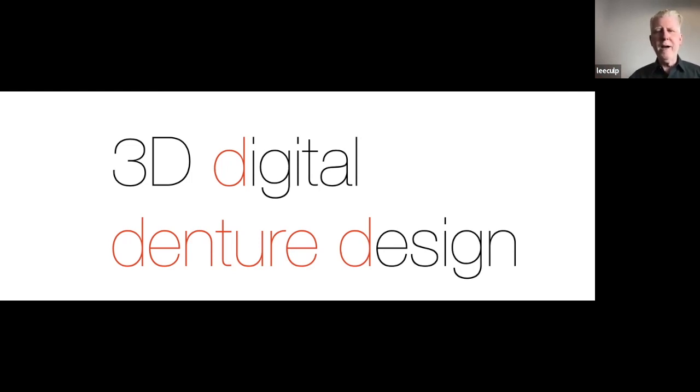So you've got two files on a face scan. You've got what's kind of like a face that looks like it's made out of clay. And a clay thing, yeah. Yeah, the clay thing, and you can bring that in, no problem. But the PLY file is the texture file that goes on the top. It's the skin, it's the face, it's the coloring. So 3Shape allowed Bellis to bring that in, but 3Shape does not allow anybody else in.